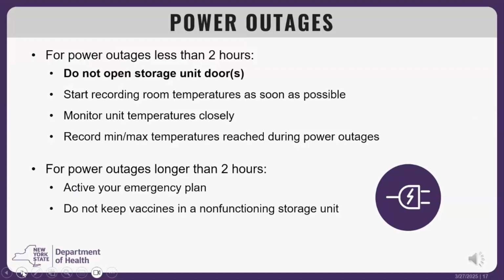For longer-term power outages lasting more than 2 hours or power outages of uncertain duration, activate your practice's vaccine emergency plan. Above all, do not allow vaccines to remain in a non-functioning unit for an extended period of time.